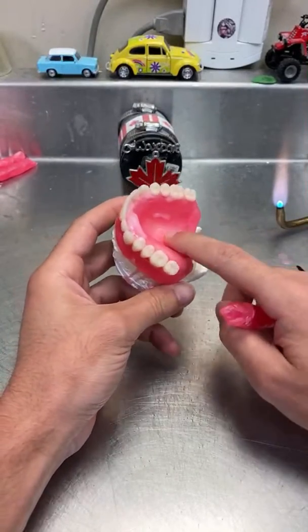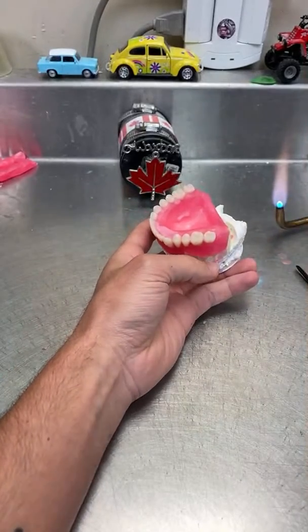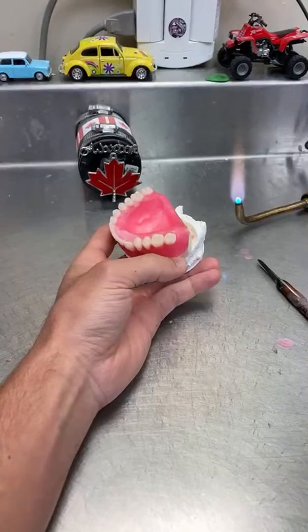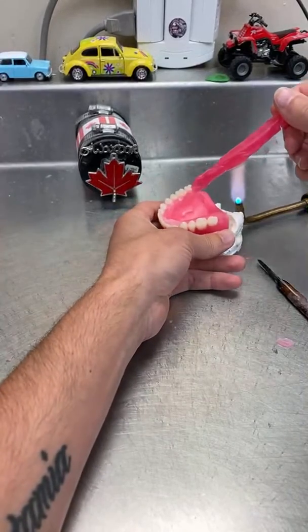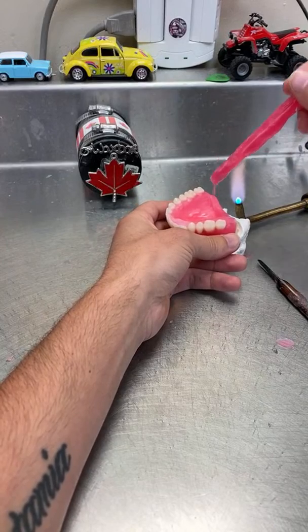Okay, so I did this here. It's like a dam, you can see it. I don't know if you can see it well. I got wax here, and I'll just make this space thick by adding more wax.